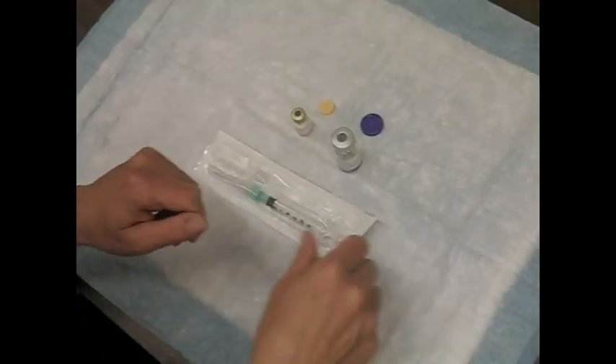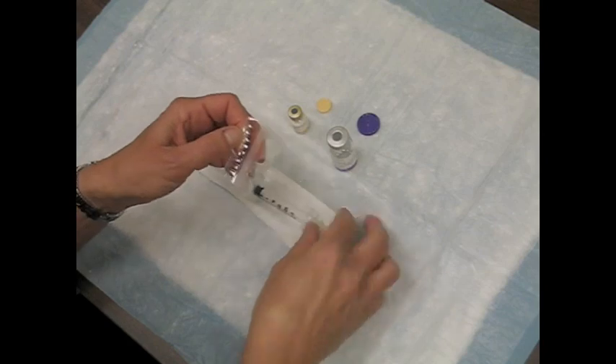Shake the emulsion and suspension and inspect visually for any abnormal physical appearance.